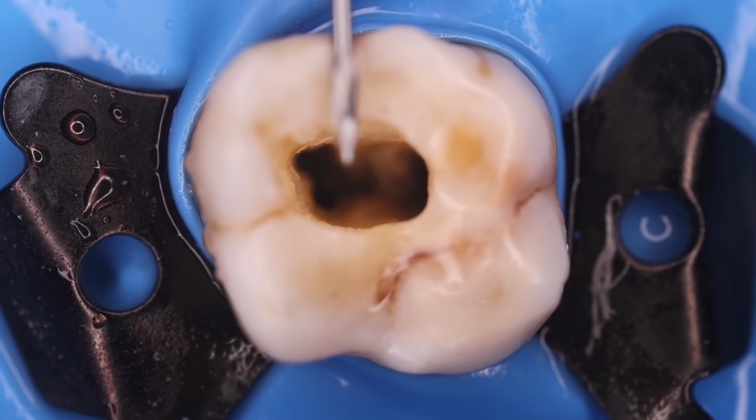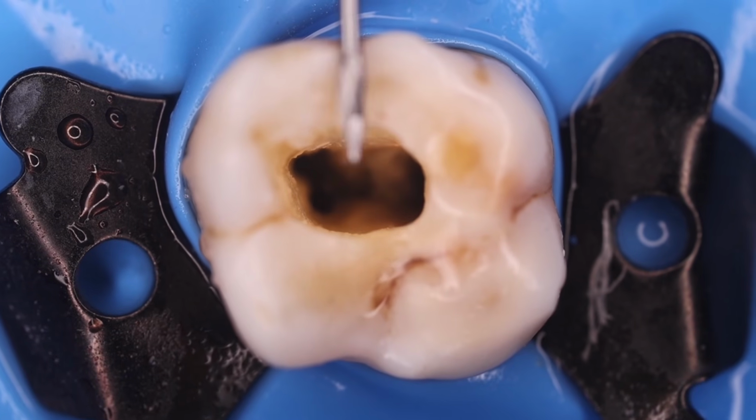Now coming to size 3 to enlarge the canal orifices.